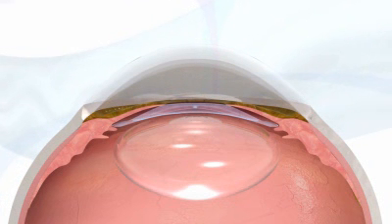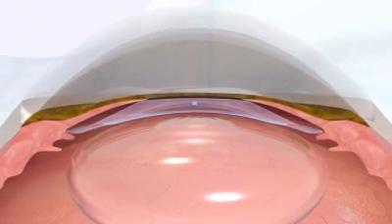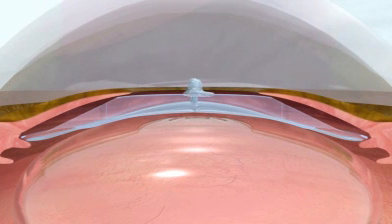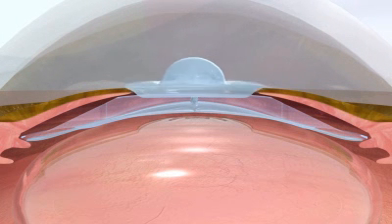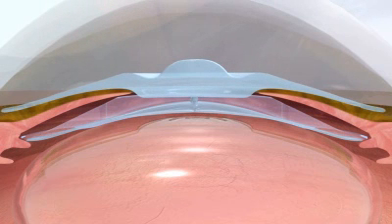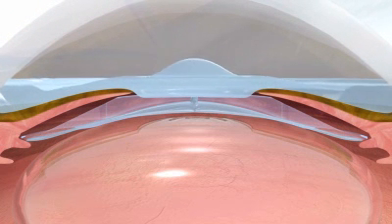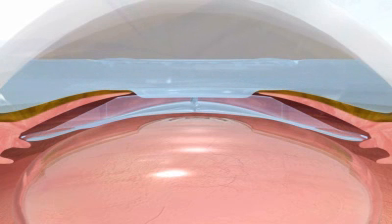The KS Aqua port facilitates the flow of aqueous humor through the eye without the need to create PIs. The port's unique design helps the aqueous maintain a more natural path through the center of the pupil. By eliminating PIs, you can offer your patients enhanced convenience and comfort by reducing surgical steps previously required for Visian ICL surgery.